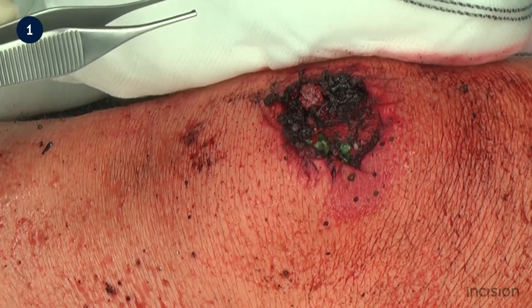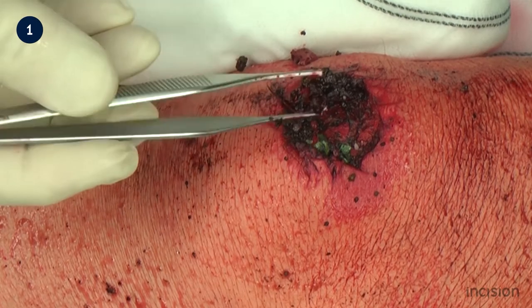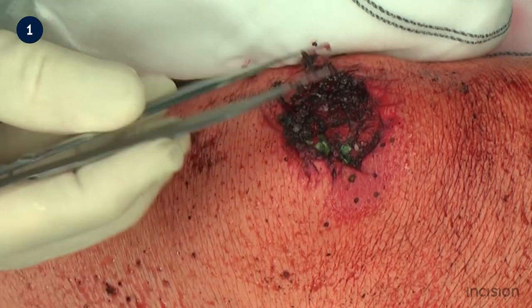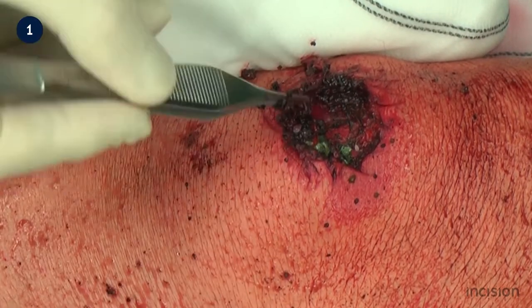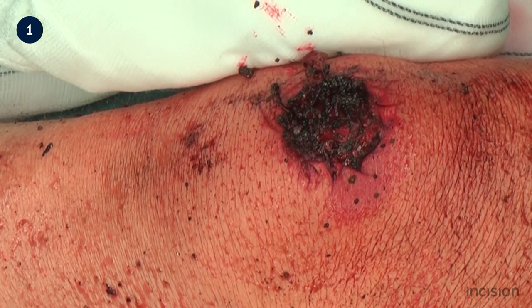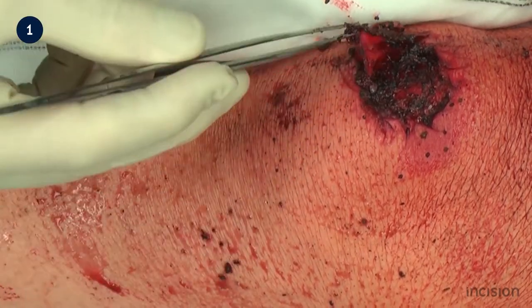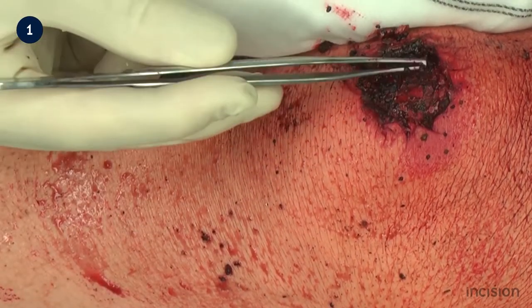Using forceps, all foreign bodies are removed from the wound and surrounding tissues. This may include pieces of glass, gravel, wood splinters, missile fragments and pieces of clothing. As much debris as possible is removed from the wound at this stage.